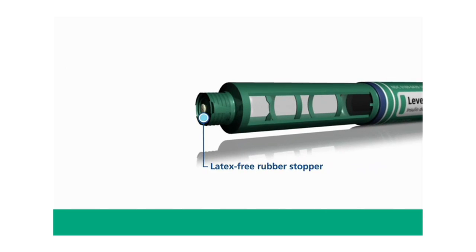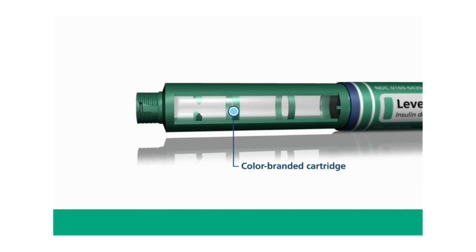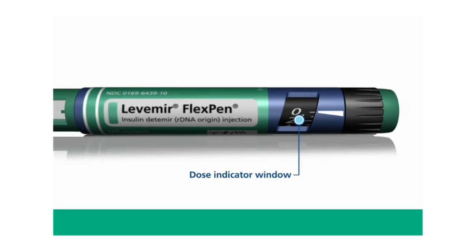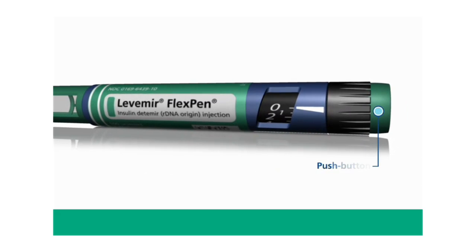The eight key parts are: the pen cap, latex-free rubber stopper, cartridge scale, color-branded cartridge, dose indicator window, pointer, dose selector, and push button.